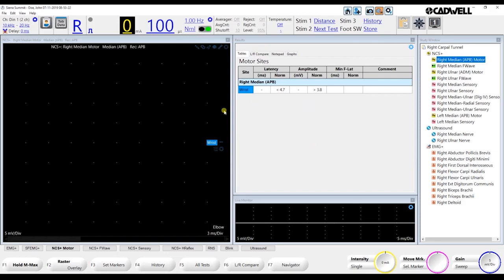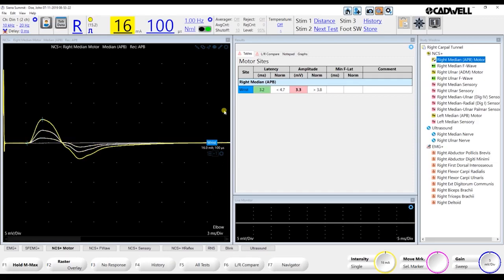So I put on my electrodes and I'm just going to start stimulating. So I'm going to stimulate the wrist here. That's the side I'm on. And we have something called trace or glowing feature. What this is, it's actually showing you the trace history as you stimulate, and it slowly fades away into the background, so you can make sure you're getting a supramaximal stimulation.